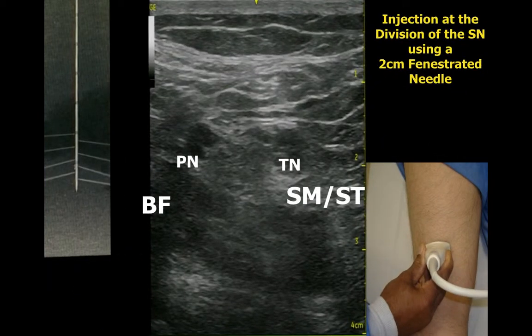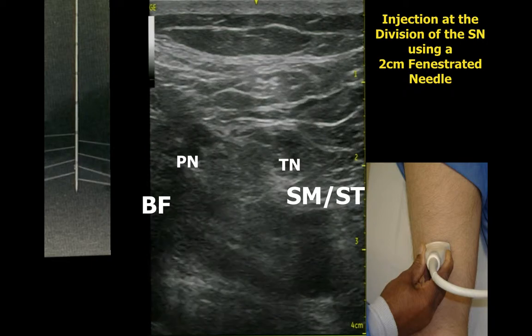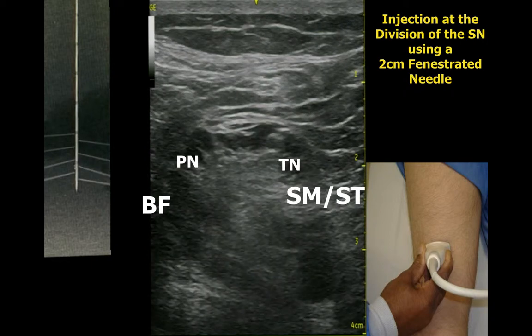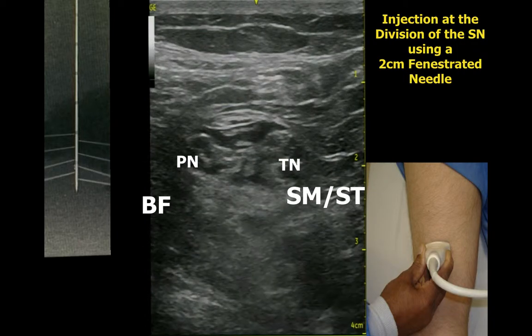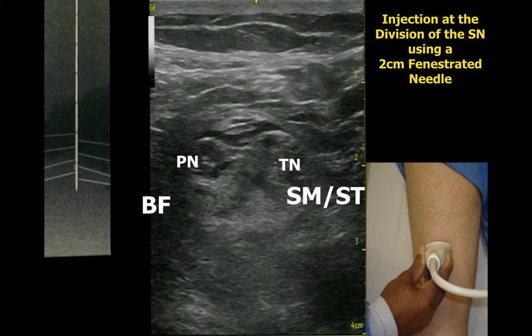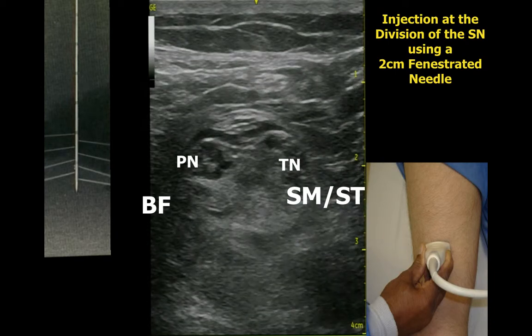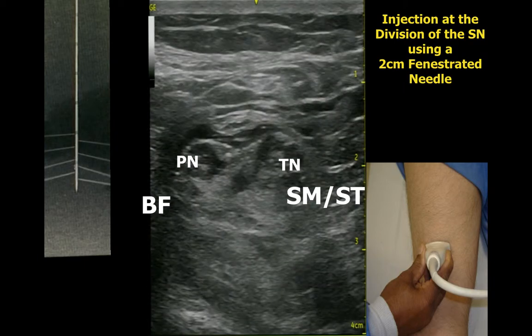In our last example, we will show the distribution of local anesthetic produced by injection through a fenestrated needle with 8 side ports on alternating levels along the distal 2 centimeters of the needle. The outflow pattern from the needle is displayed on the left of the screen. You will also note connective tissue oriented in a coronal plane both between the nerves and superficial to the nerves.